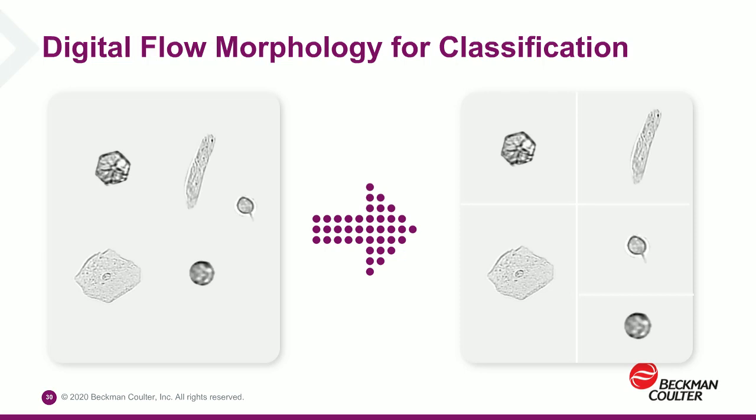An example of this could be subclassifying crystals into a specific type, such as calcium oxalate or triple phosphate, versus simply reporting unclassified crystals present. The system does this with an over 90% confidence interval, so you can be confident that you are getting and giving accurate results.